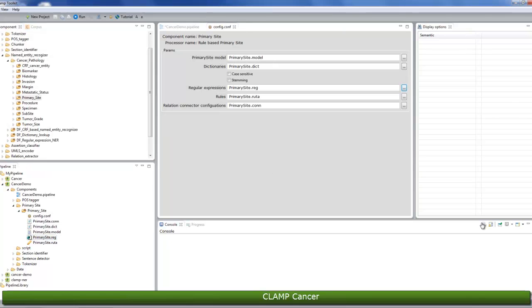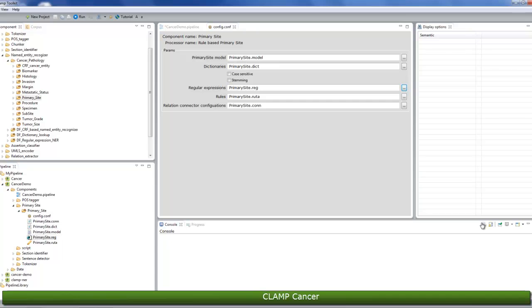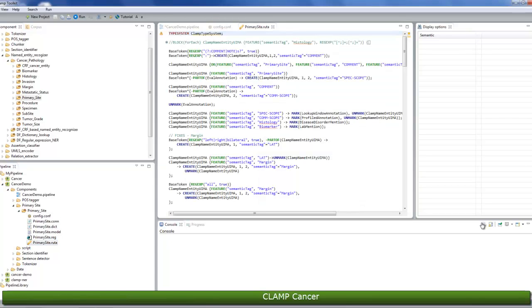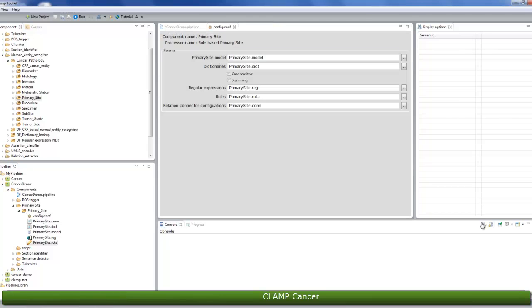In certain cases, you may need to use machine learning to post-process your data. You can do so with the rules setting. Again, similar to the primary site dictionary file, you can either edit or replace the rules file. You can edit it by double-clicking on the file in the pipeline panel or you can replace it by using the three dots button next to the field.